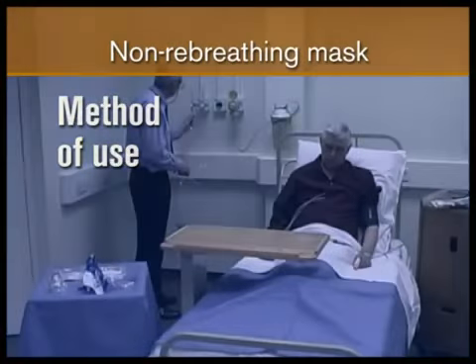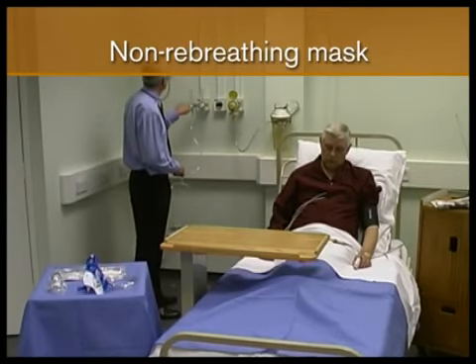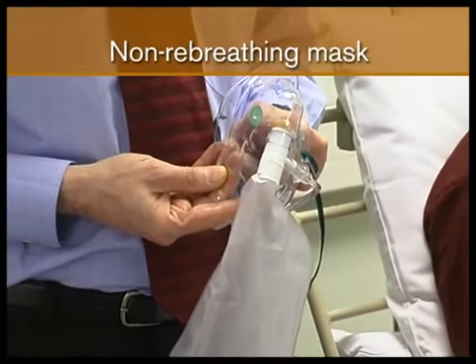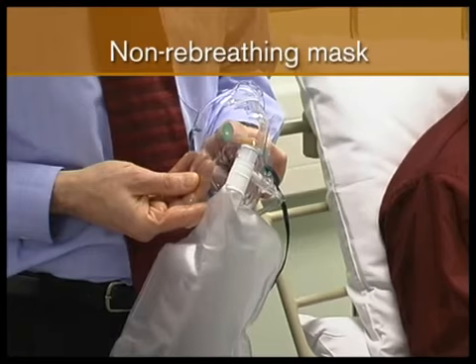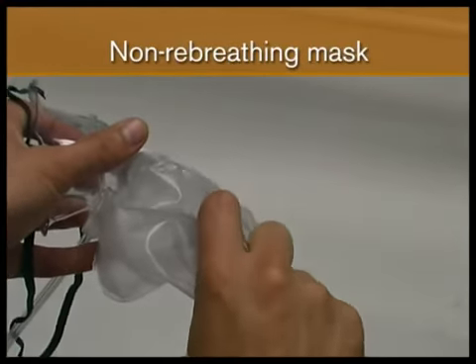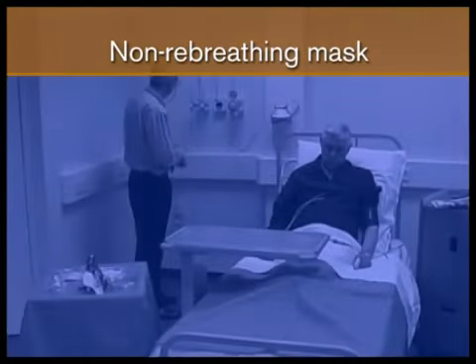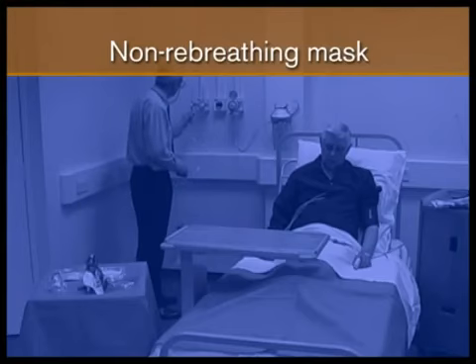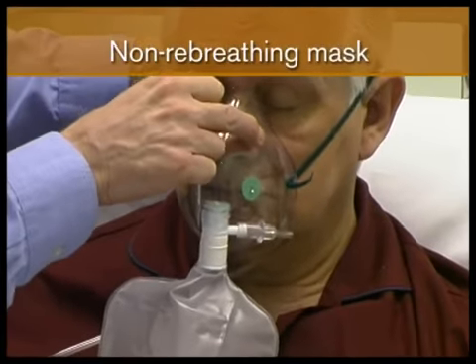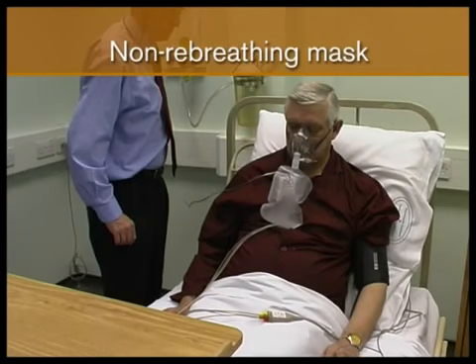When using the non-rebreathing mask, first attach the oxygen tubing to the oxygen flow meter and set the flow rate to 15 litres per minute. Occlude the inspiratory valve, being careful not to damage the valve, and allow the reservoir bag to fill. Squeeze the reservoir bag to test the patency of the valve between the reservoir bag and the mask. If the reservoir will not empty, discard the mask, choose another and test again. Place the mask on the patient's face, obtaining as tight a fit as possible. Adjust the oxygen flow rate so that the bag deflates by about 1/3 with each breath.